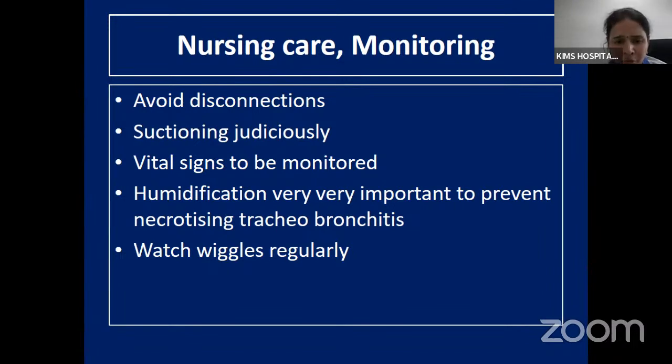The vital signs of the newborn, especially the heart rate, the blood pressure, signs of peripheral perfusion, the urine output, and periodic monitoring of the blood gas, particularly for carbon dioxide washout, are very important. A chest X-ray may be initially done after 1 hour of initiating high frequency ventilation. And normally on the X-ray, we expect around 8 to 9 posterior intercostal spaces.